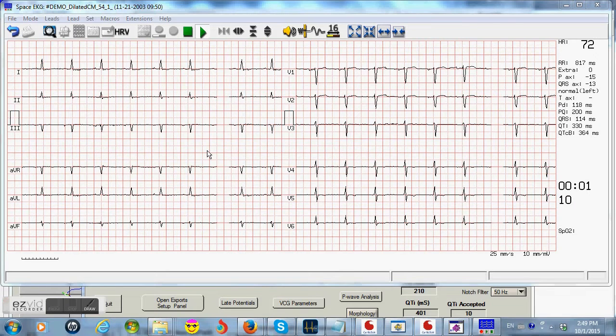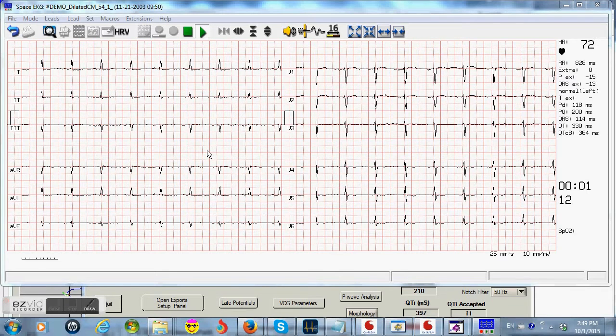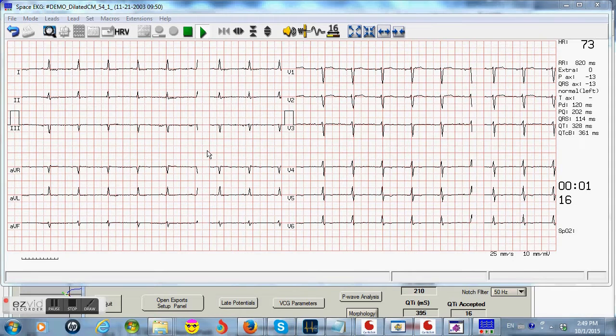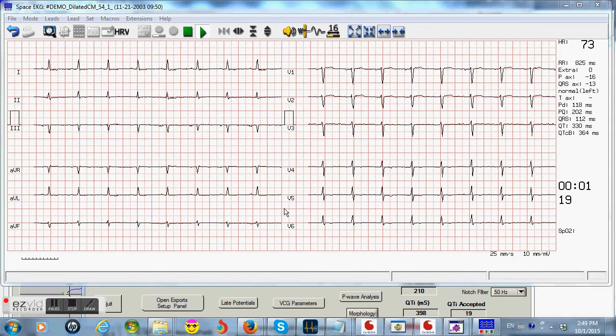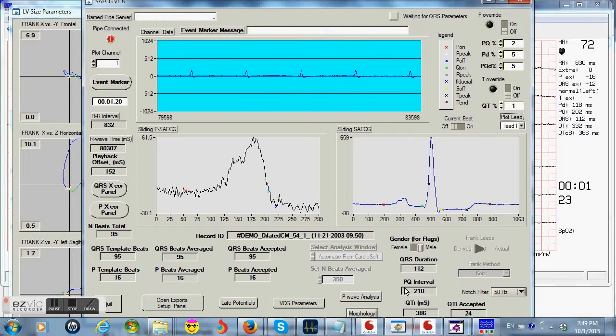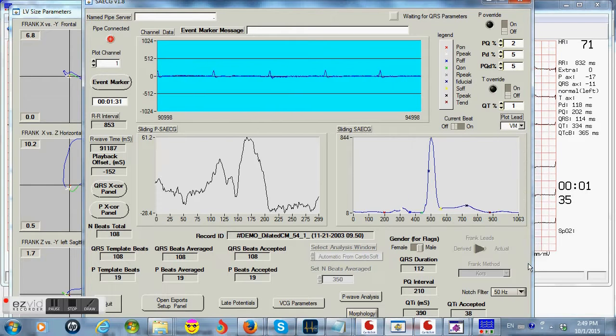Let's move on. We'll start to run the recording, and we'll go into our advanced ECG applications again, and we will start with our signal averaged A-ECG. We're about a minute into the recording, and let's look at our fiducial points. Let's make sure that our fiducial points are correct, so we always know that the information we get out in the parameters is correct. This is lead 1. Let's switch over to the vector magnitude, which is the main lead that we use, and those fiducial points look good to my eye, so I think I will trust our results.